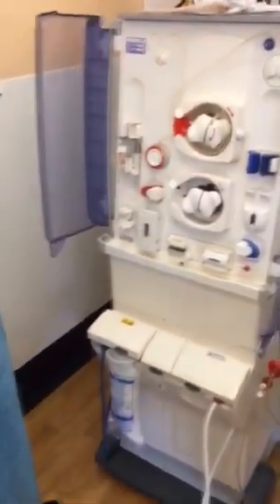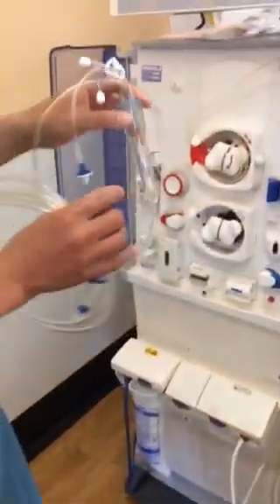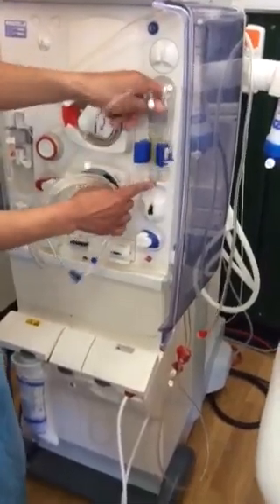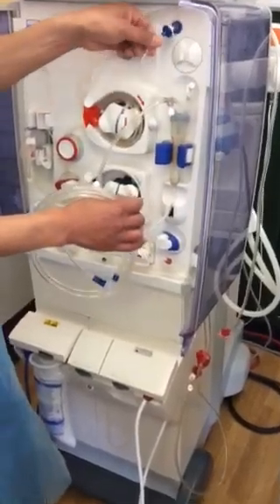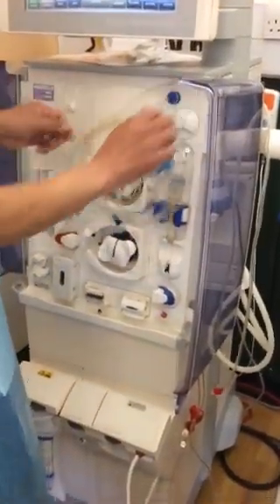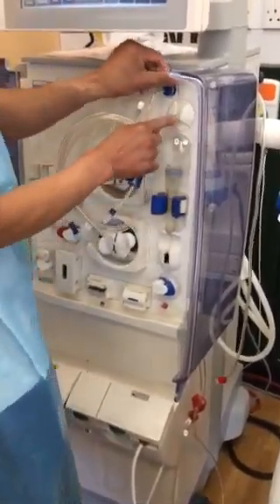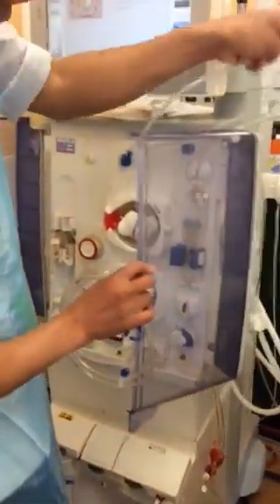Now I'm going to get the venous line. Okay, this is what you call the bubble trap. Just take it in between here — it will rest from this one. But before that, you have to put this one here. You're going to tighten it — just tighten it — or else there will be air.